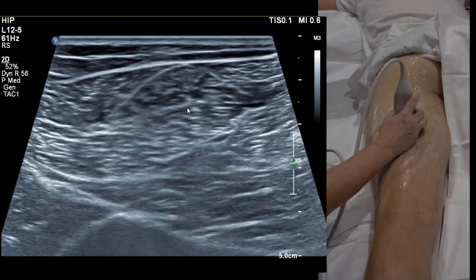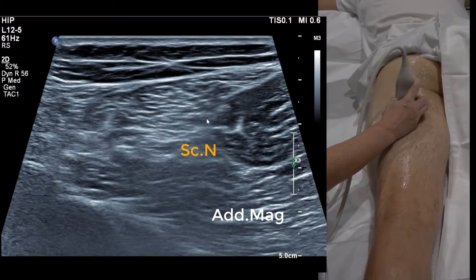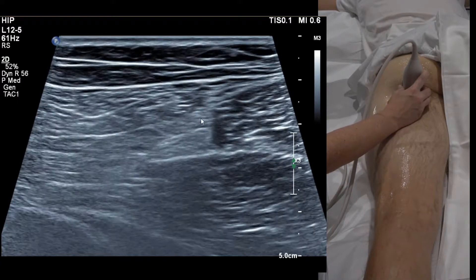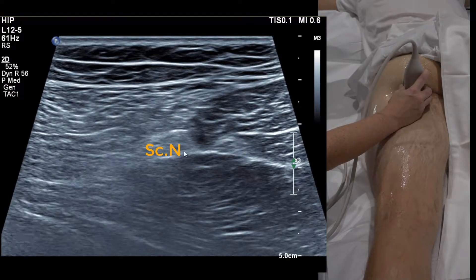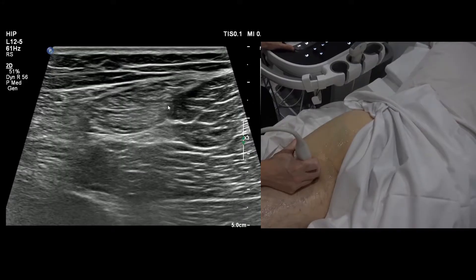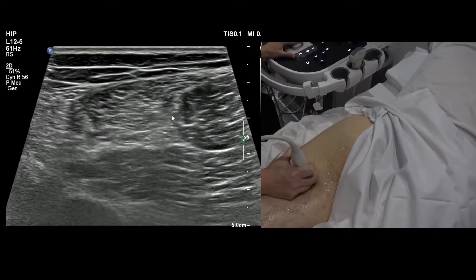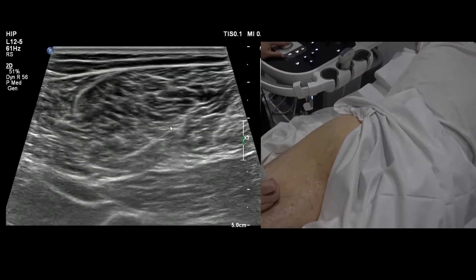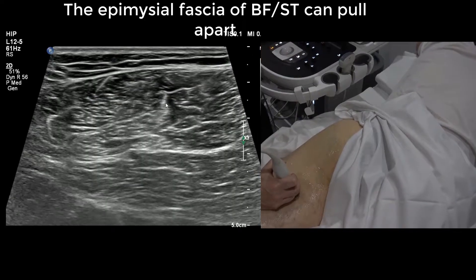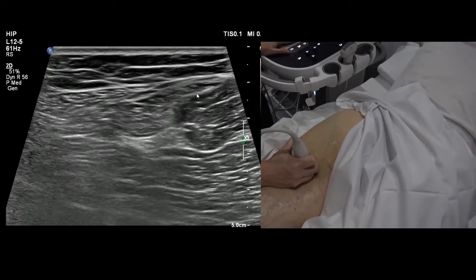Further up towards the gluteal fold, biceps femoris becomes small. This white line is shared between the lateral and medial hamstrings. Just beneath that vertical white line is the sciatic nerve, and the other side is adductor magnus. The conjoint tendon is really helpful because it basically draws a line down to the sciatic nerve — and if you're going to find a hamstring tear, it's nearly always flanking that conjoint tendon. Running down, if the tendon looks thick, you may see the two fascias split apart with hemorrhage between them — compare with the other side.